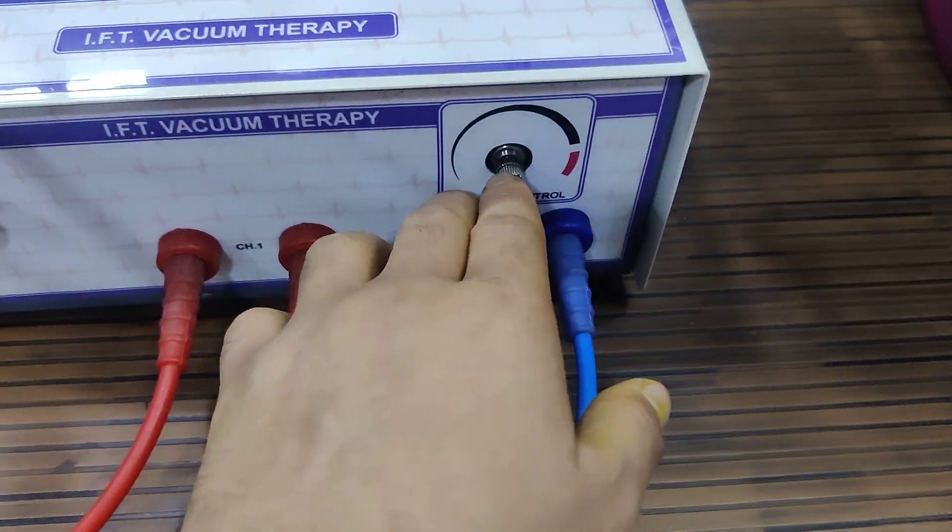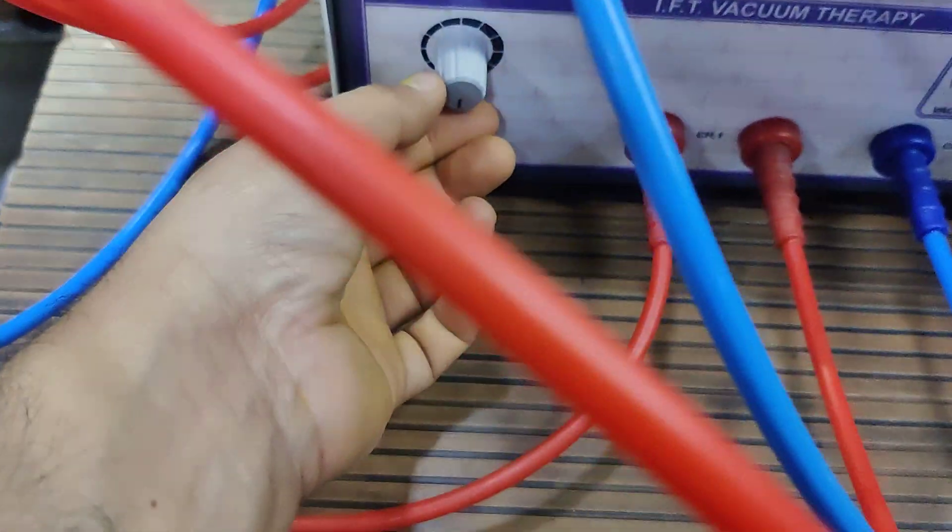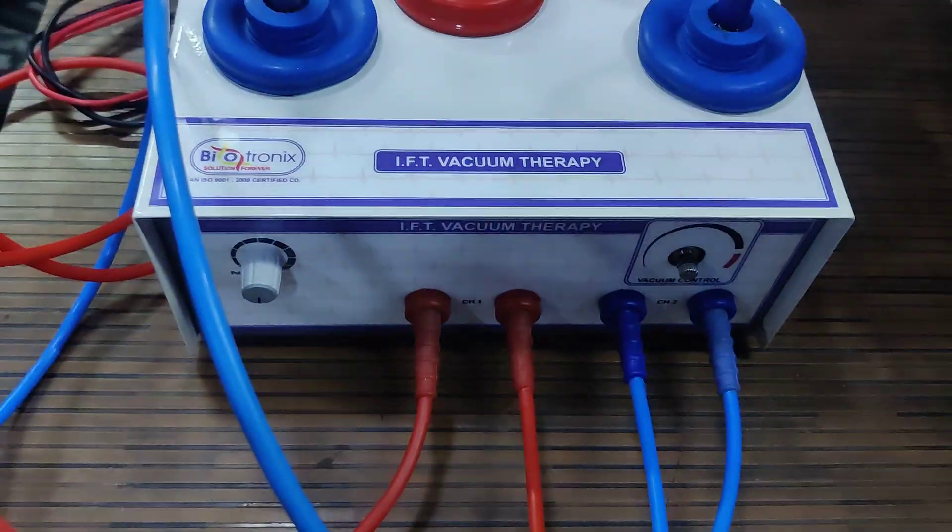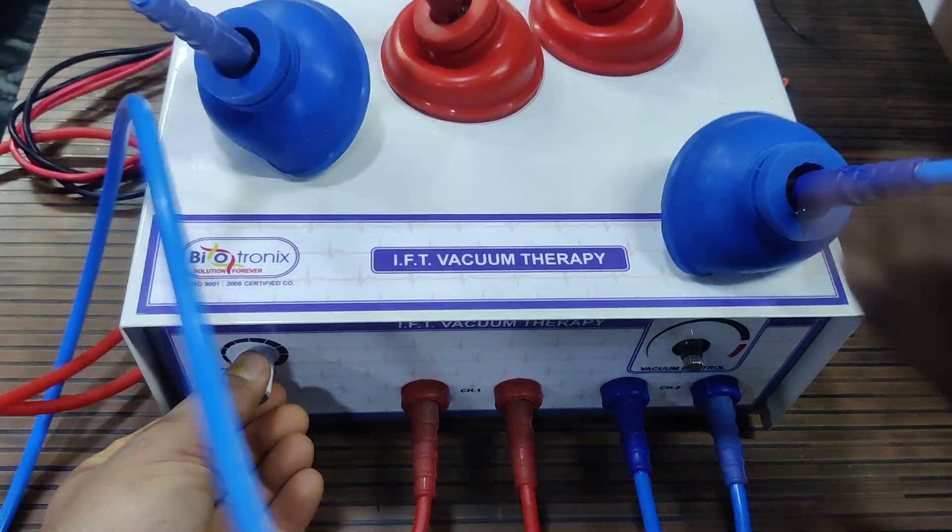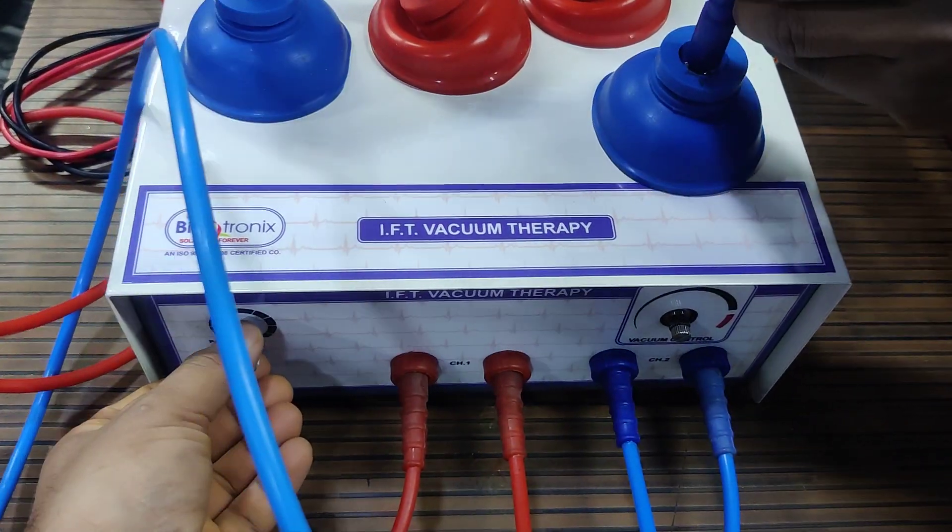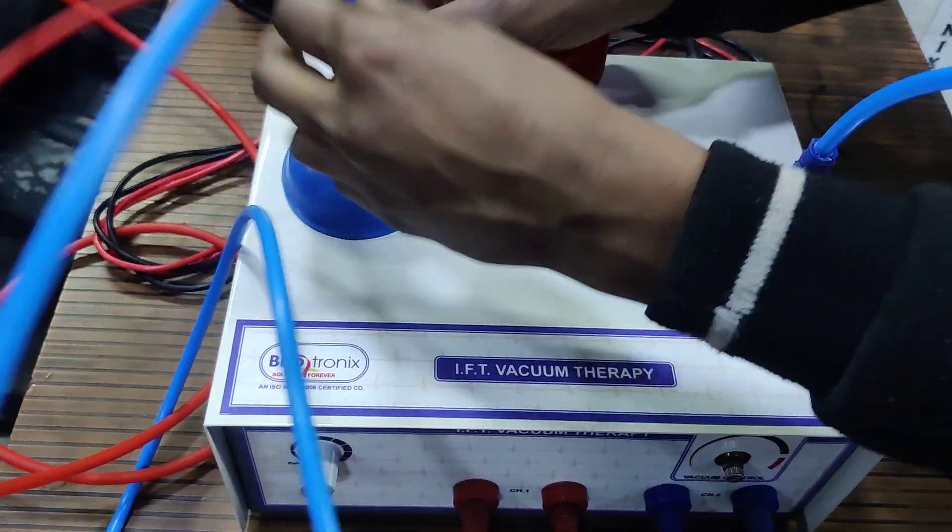And these are the controllers to control the vacuum intensity. And this is the pulse mode. You can use the pulse mode to get the pulse of the vacuum. This is the vacuum working in the pulse mode.